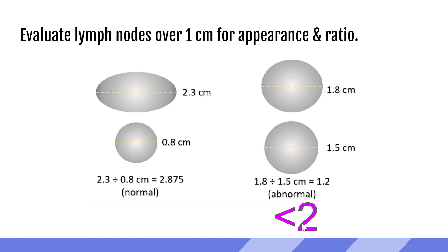So as we're looking through, if we see anything over 1 centimeter, we're going to stop and look at it. We're going to go through our checklist to make sure everything looks normal, or if it clearly looks abnormal. Then we'll look at measurements. If it's on the larger side but still falls into a ratio of 2 or more, it's probably just a reactive lymph node. However, if we are getting that ratio under 2, we are much more concerned about it being an abnormal lymph node and we definitely need to document those. Size isn't everything — that ratio and the appearance both play a really big role. But for anything over a centimeter, stop and take a closer look.